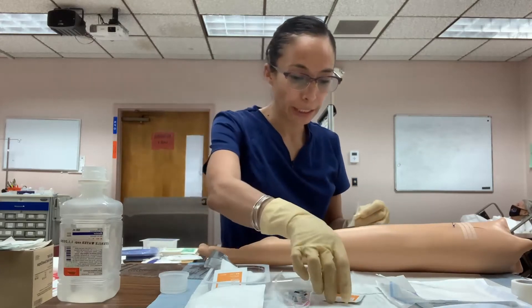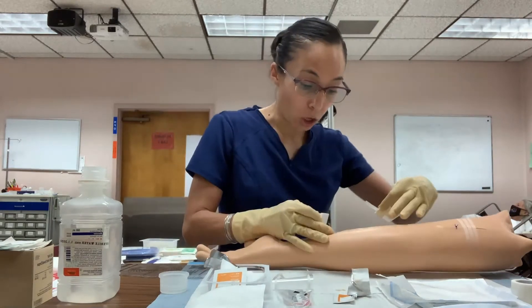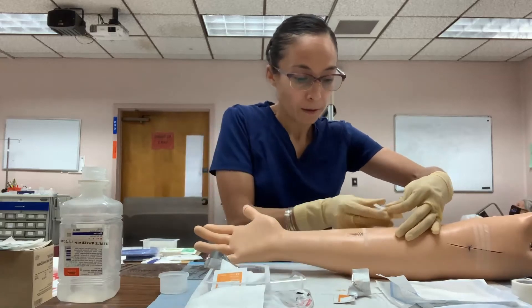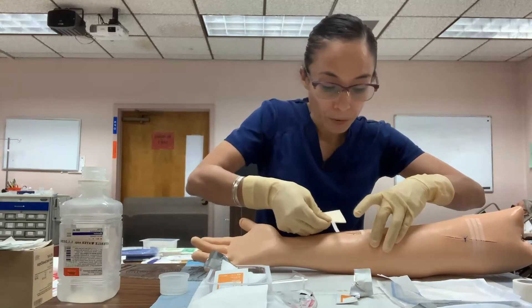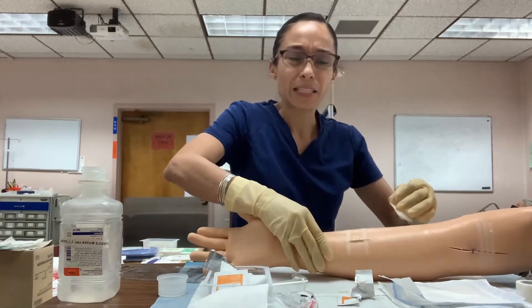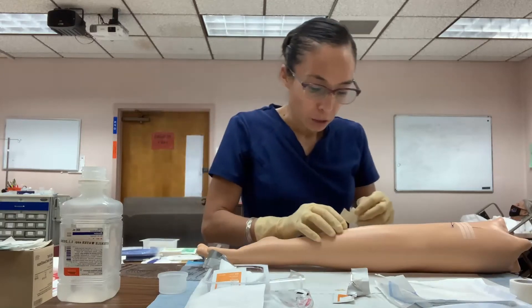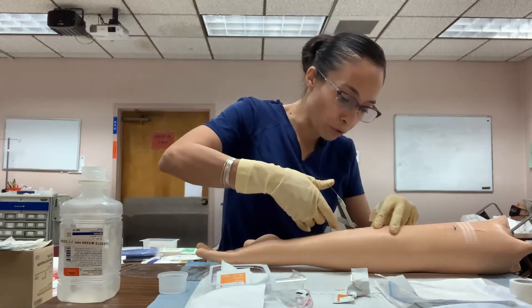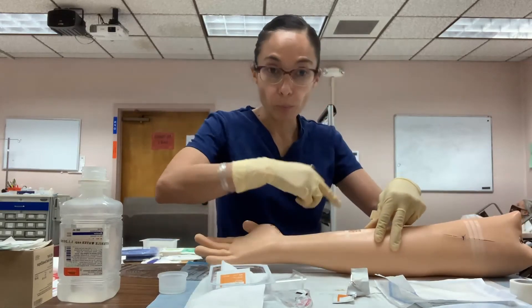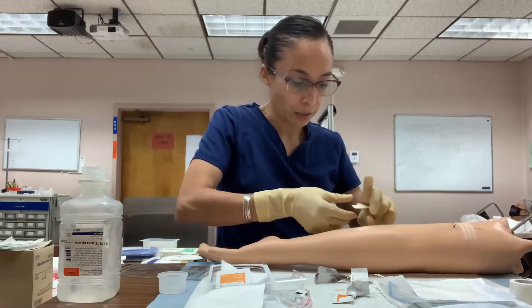Before applying steri-strips, clean the surrounding skin with the skin barrier. Make sure the skin barrier is applied only to the skin surrounding the incision — not inside the incision itself. Wait for it to dry slightly, then apply the steri-strip, ensuring it holds the wound edges firmly together. There is no point placing a steri-strip if the edges remain open, as that will result in a bumpy scar. Apply steri-strips in between each removed staple as you go.